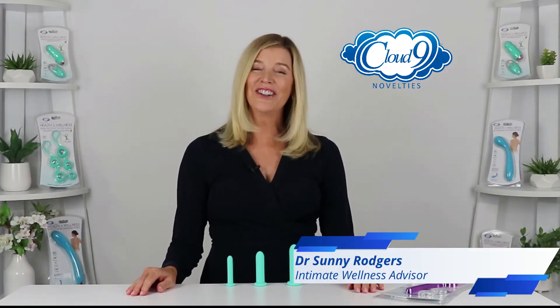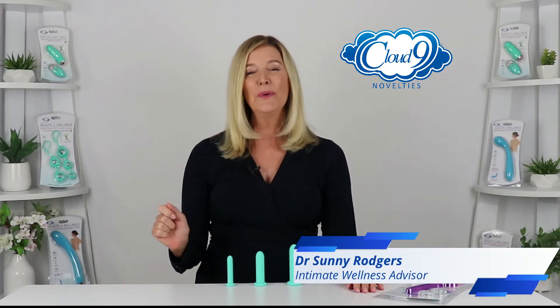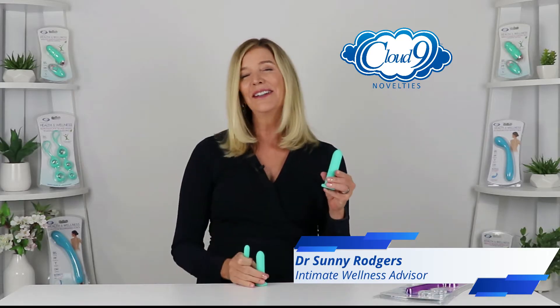Hi, I'm Dr. Sunny Rogers and I'm here to introduce you to this silicone graduated dilator kit from Cloud9 Novelty's premium health and wellness collection.